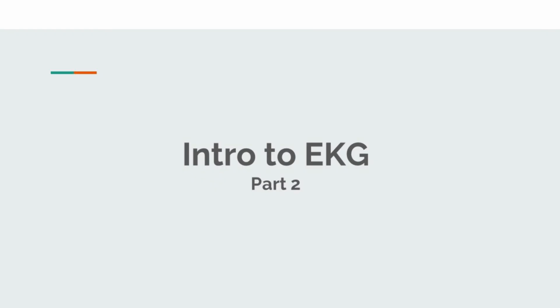That's going to be it for part 2 of the Intro to EKG video. In part 3, we will finish going over how to interpret the EKG.